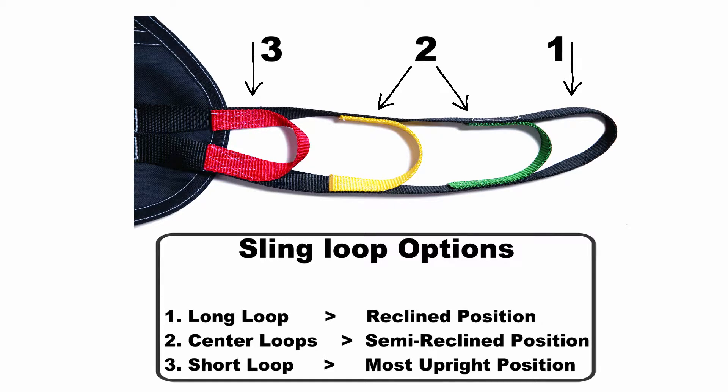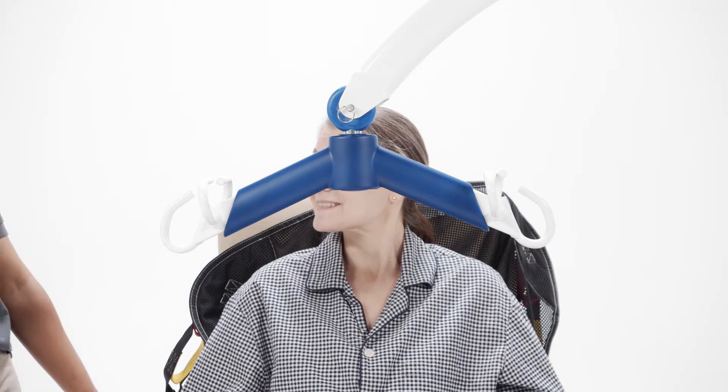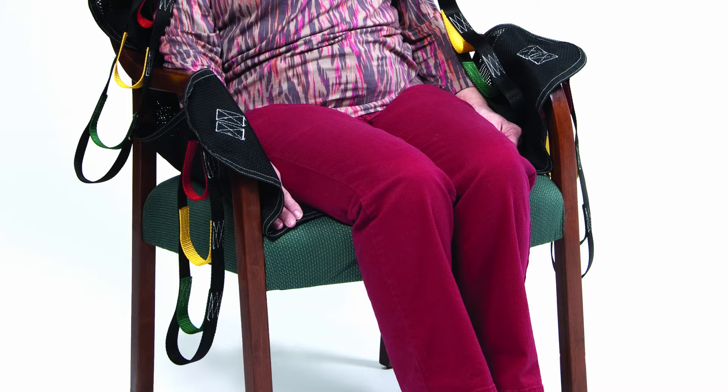For this demonstration, we are going to use the reclined position. Position the sling underneath the patient with loops A and B over the shoulders and the label and back strap facing away from the patient. Carefully, with help from another caregiver if needed, pull the sling portions C and D forward to the bend of the knee.